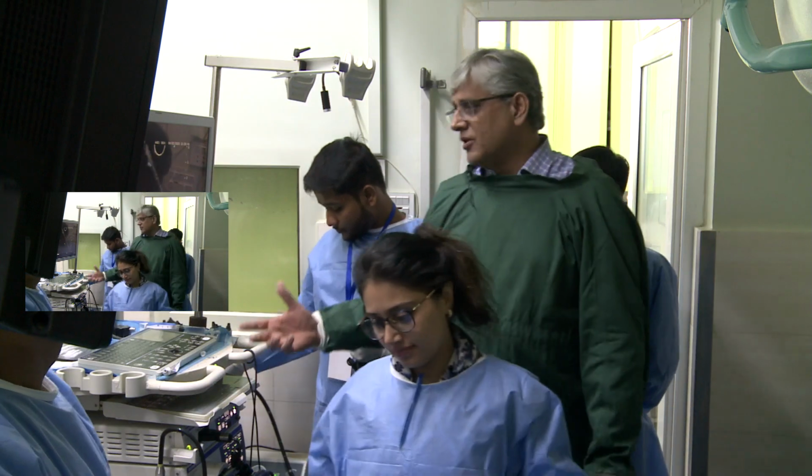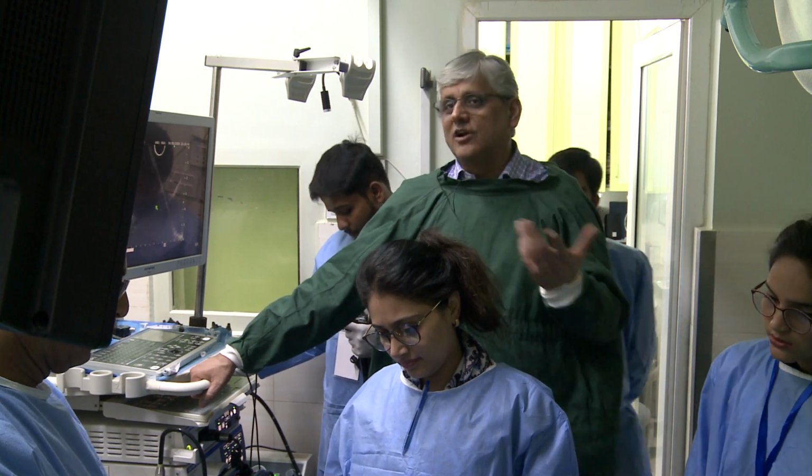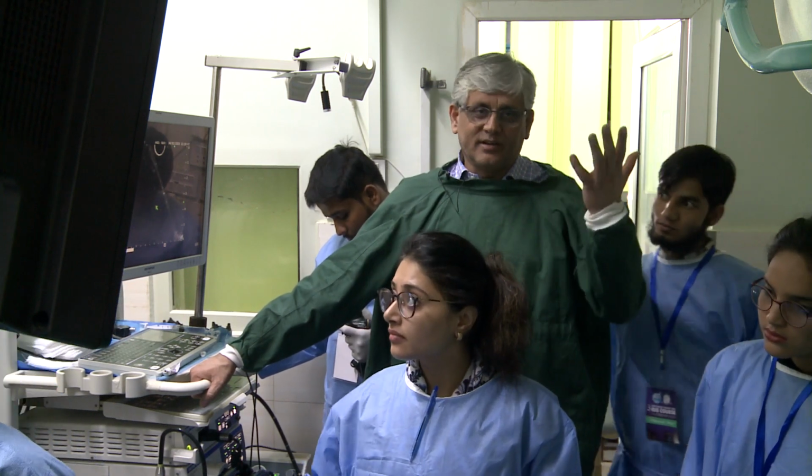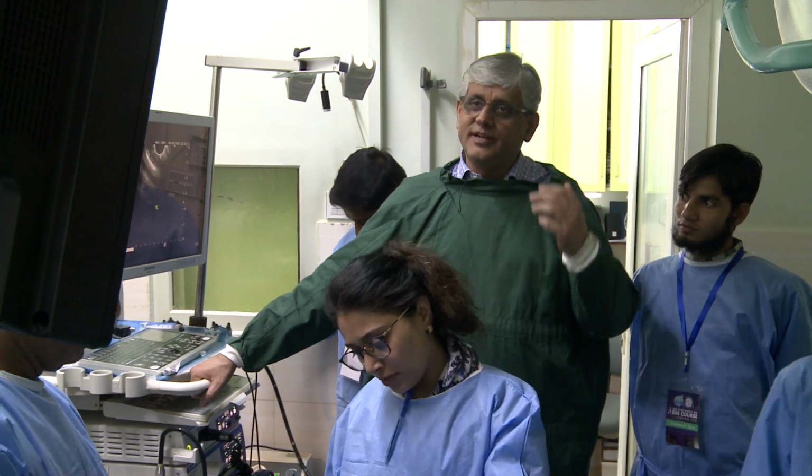So in this, the problem is the reporting. Generally, what I would write, and if there's anything you want to add, I usually would go in straight to the CBD stent seen.